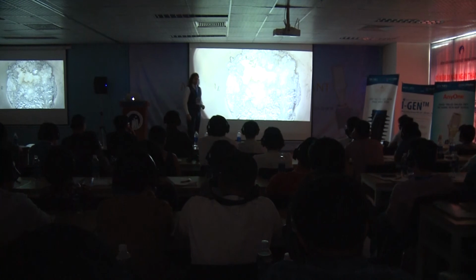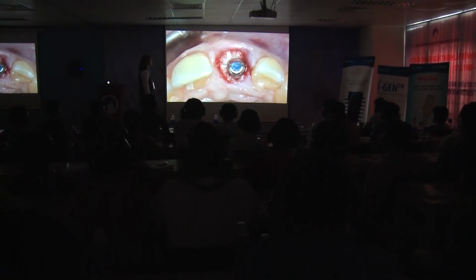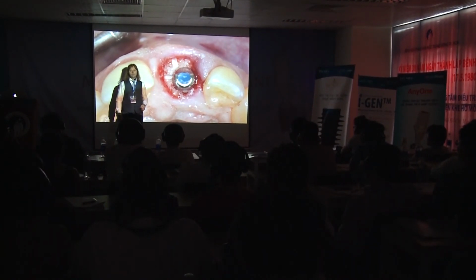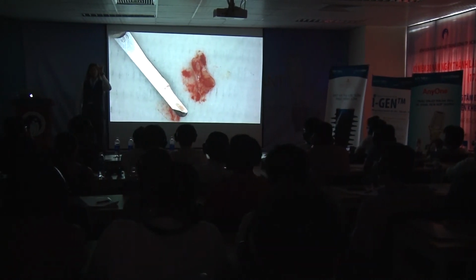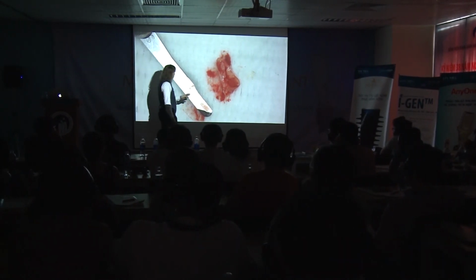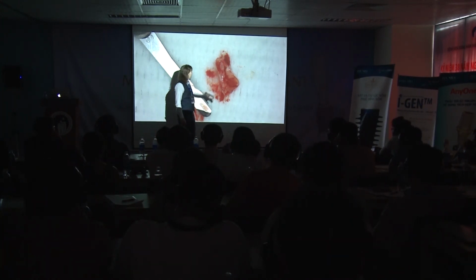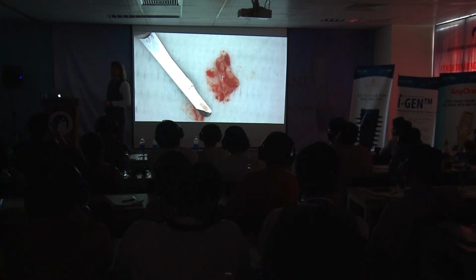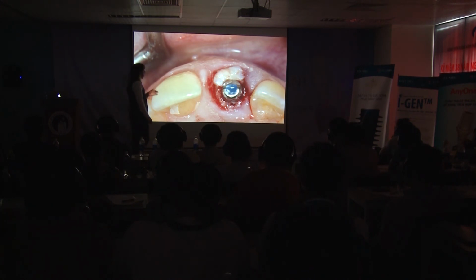I place some bovine bone in the buccal bone. And my mistake was I placed too much. So I took a little piece from tuberosity. Very little. This is 2.5 millimeters, a Beaver blade. 2.5 millimeters, 4 millimeters. It's very, very little. I put it there after deepithelialization.